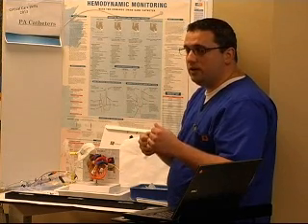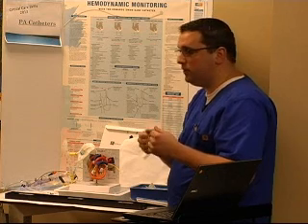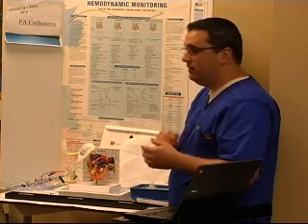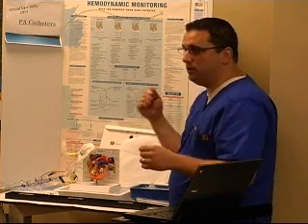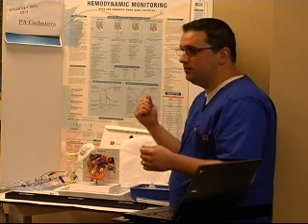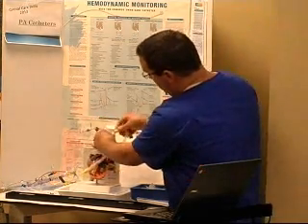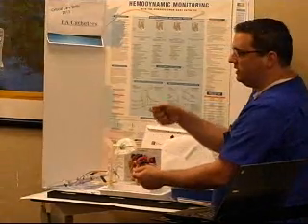What about your Chandler wire? You want to make sure that that's been DC'd before you go and pull that catheter out. If you happen to have a Chandler wire, always, always, always, it has to be pulled before you discontinue the PA catheter, okay? When you go to pull this out, you'll steadily pull it out.